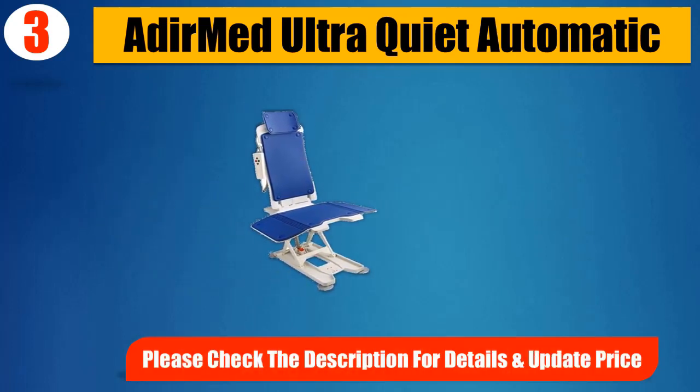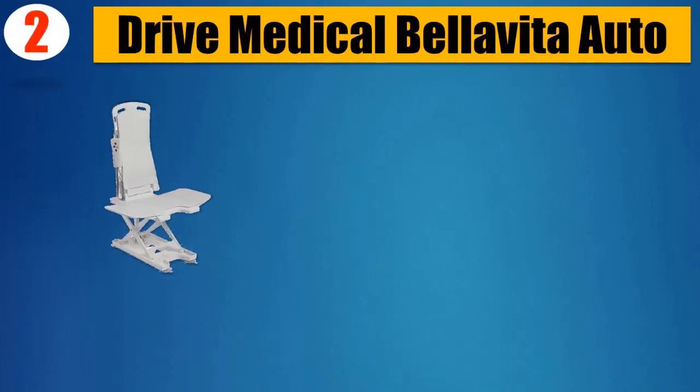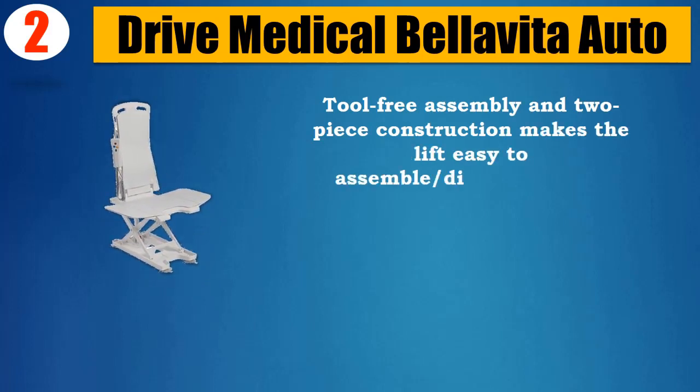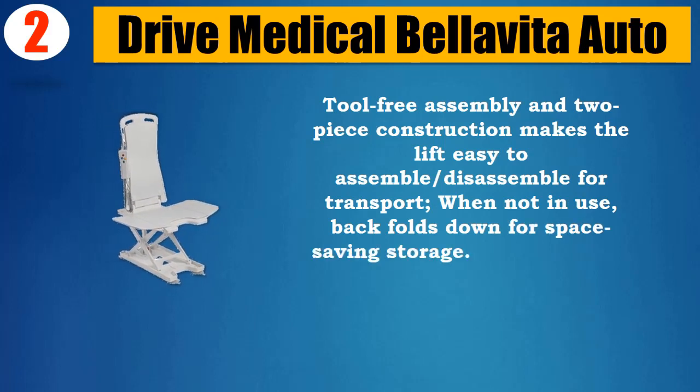Please check the description for details and updated price. Number 2: Drive Medical Bellavita Auto Aluminum. Tool-free assembly and two-piece construction makes the lift easy to assemble/disassemble for transport. When not in use, back folds down for space-saving storage.